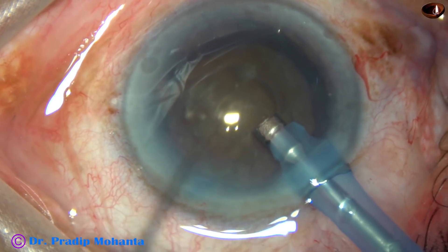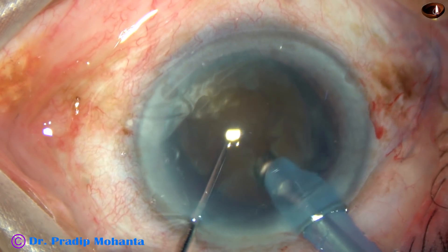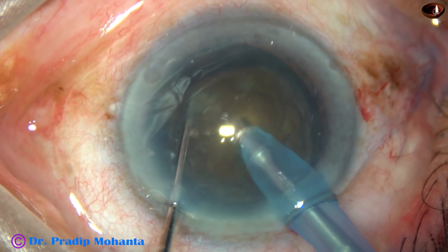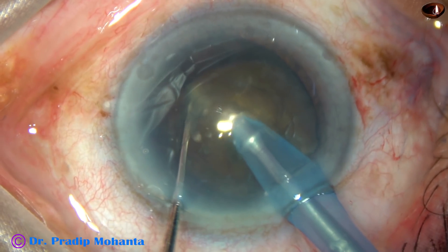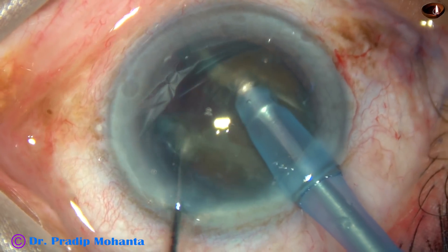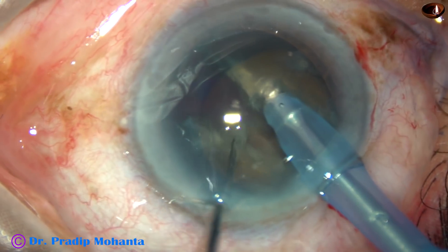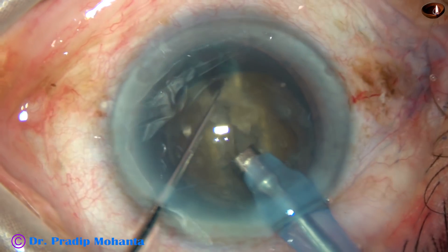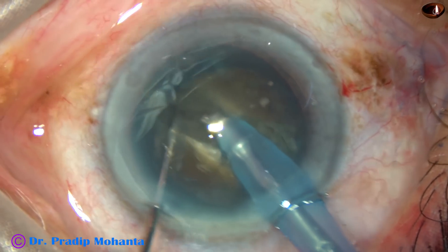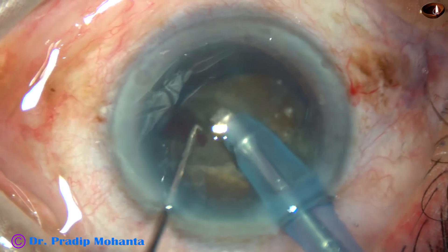Now, the handpiece is turned so that the bevel is up. Push the nucleus a little down. Bury the tip. Go through the substance of the nucleus towards the opposite equator — I call this the Submarine chop. The nucleus has been divided nicely into two halves.